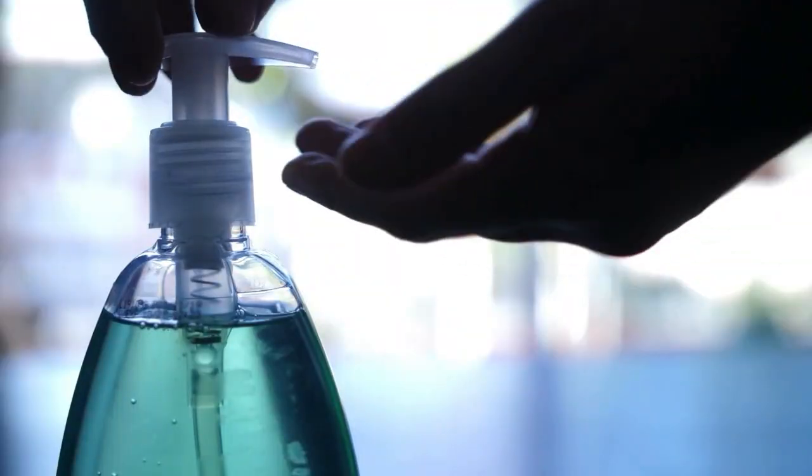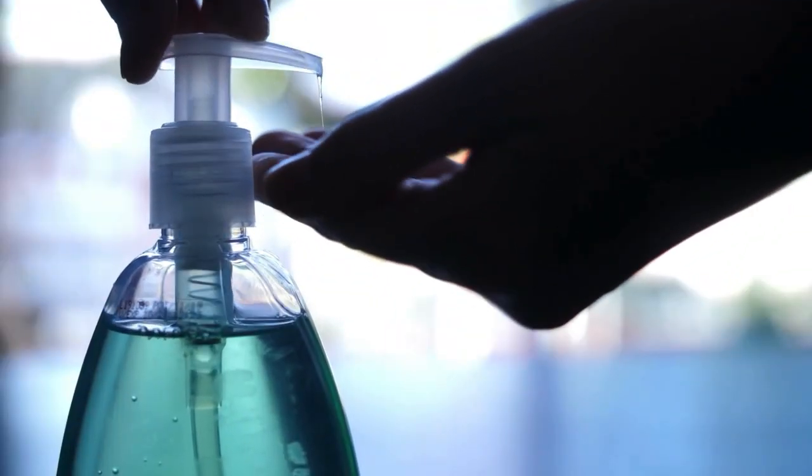Well, what I'll do is I'll wash my hands again, make sure they're dry, and I'll do 2 to 3 finger sticks more before calibrating. I'll usually do 2 measurements with my meter, and if they're fairly similar, I'll use those numbers for the calibration. If they're not, and this does happen, meters don't necessarily give the same readings over and over, so if they're not, I'll do a 3rd measurement. I'm doing all of this because I really want to make sure that I'm feeding my CGM an accurate blood sugar number. I currently use Dexcom G7, so let me show you how to calibrate Dexcom G7.